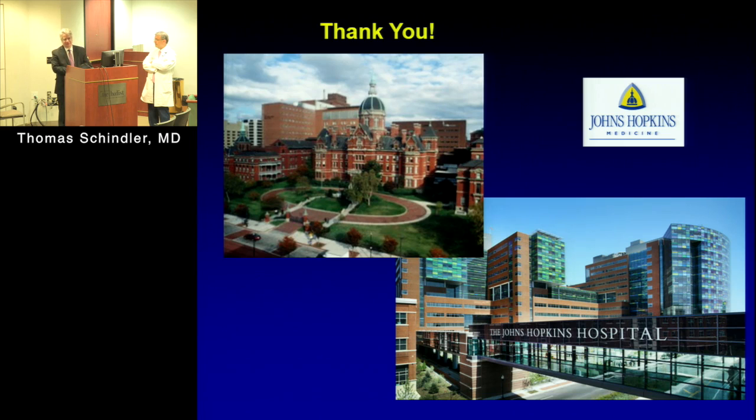I think currently no. I think it may be coming up when MRI comes with parametric imaging with novel parameters. And when you go into receptor imaging or metabolic imaging, where you need to know the location to compare two parameters, metabolic parameter from PET and structural parameter from MRI. And then in the remodeling process, what is happening in the remodeling? You may have myocardial infarction of the inferior wall, small sized. Some patients develop severe heart failure, and some patients maintain global function over their whole life. And no one knows really what is happening in the myocardium.